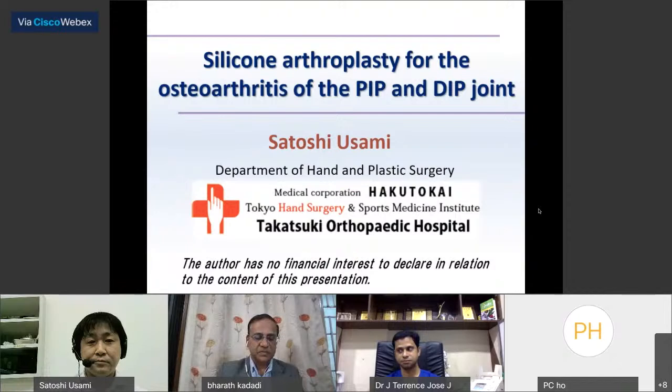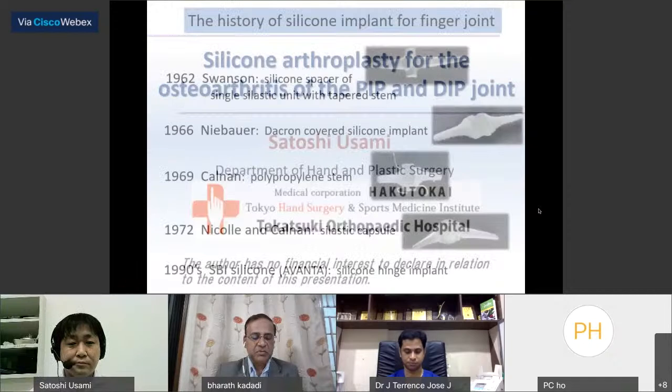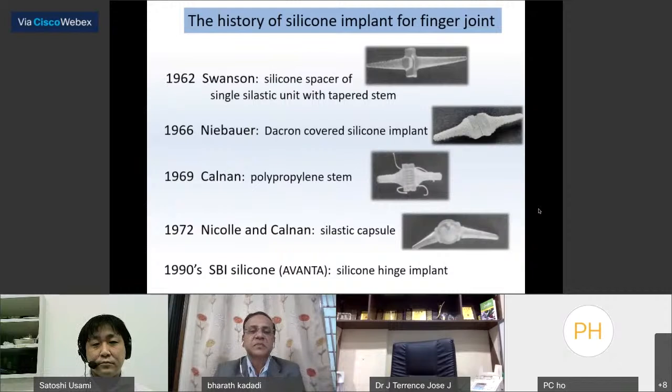In this seminar, many presenters mentioned surface replacement type arthroplasty, but I'm going to present silicone implant arthroplasty for osteoarthritis of the PIP and DIP joint. Regarding the history of silicone implants, Swanson presented and generalized the silicone spacer for small finger joint arthroplasty in the 1960s. Thereafter, so many types of silicone implants were developed and reported.